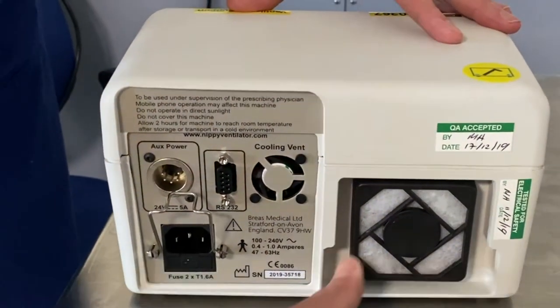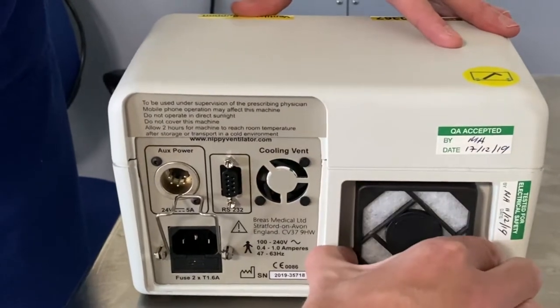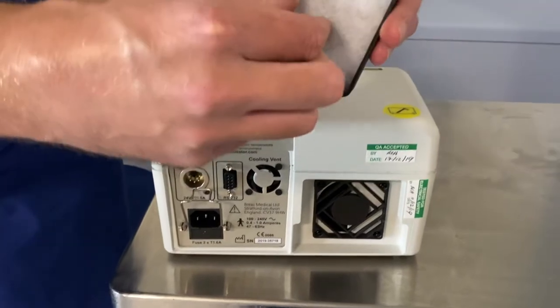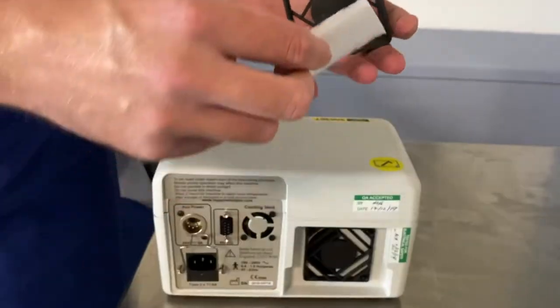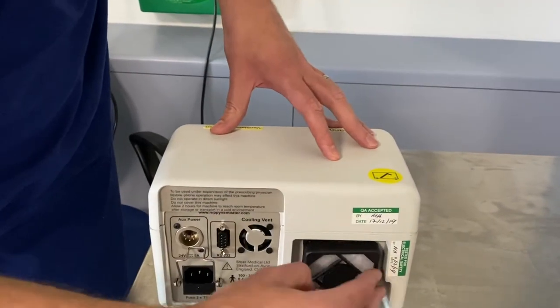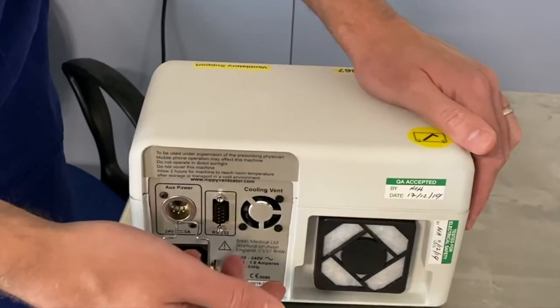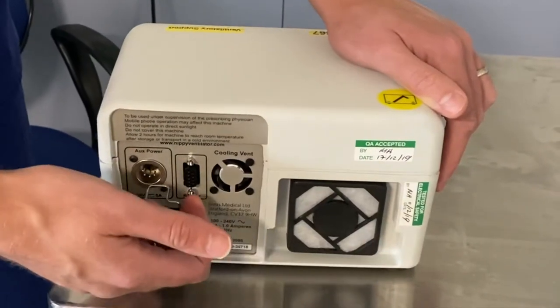To change the filter, what you need to do is place two fingers either side, squeeze and pull out. You'll see here it's a fabric filter that gets binned and then is replaced and pushed back into position. We recommend that filters are changed at least once a month, or more regularly if it appears visibly dirty or dusty.